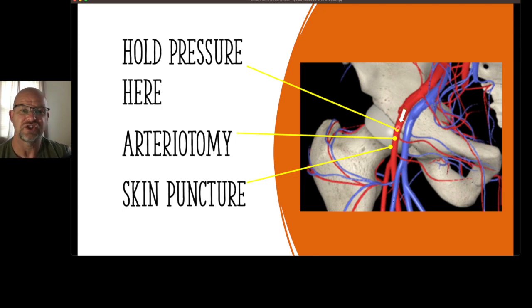One of the good cheat ways to know that you have good pressure, especially with different body habitus, it can be very challenging to know, do I have good control over this? Early on, when that sheath comes out, you can feel the sheath in there, and as it comes out, you can feel that pulsing. If the hematoma has developed, that can be quite challenging to find. But a pulse oximeter on the toe of that affected leg, when you hold good pressure, you can obliterate that waveform. And then when you let up a little bit, that waveform is restored. So you're at the right site.